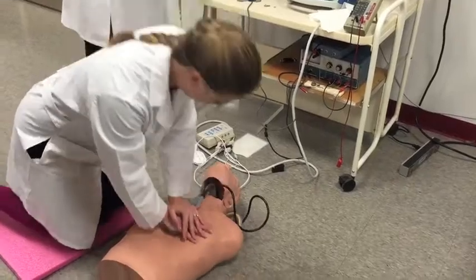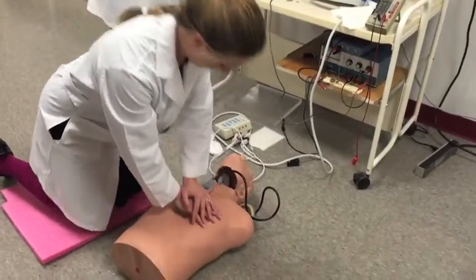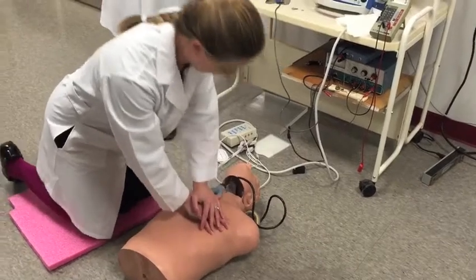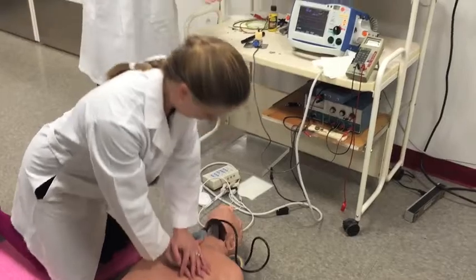This one has a metronome to help you keep the pace, which we found is actually pretty helpful. It also prompts for ventilating the patient, so every 30 compressions it makes a kind of honking sound to prompt you to get ventilations.